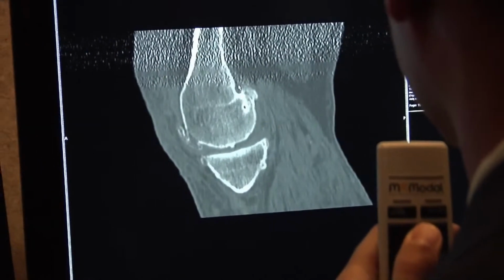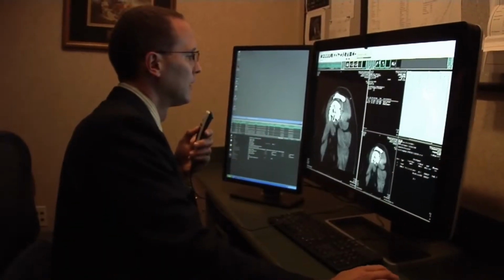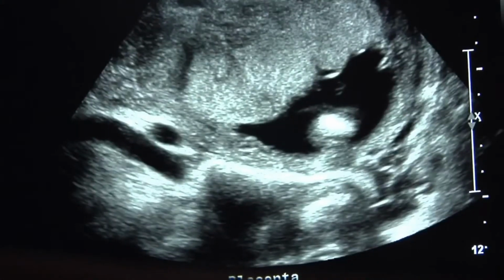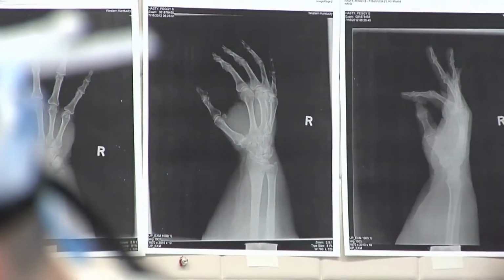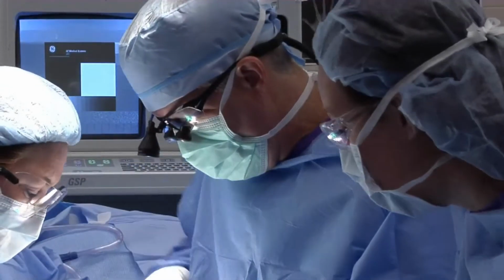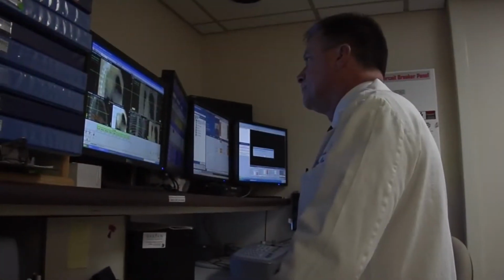For pictures, it's a combination of all the medical imaging. Archiving, it's a centralized digital electronic database where we combine all of those images. Medical staff can also use PACS to communicate, sharing reports on the findings from each image. That report is also associated on the PACS system with your images, so your doctors and nurses can pull up your images as well as the interpretation. The medical center's PACS system is highly protected to safeguard patient confidentiality while improving access to those medical staff who need it.